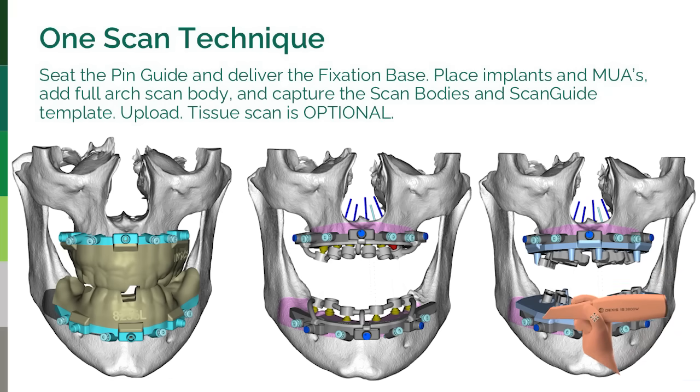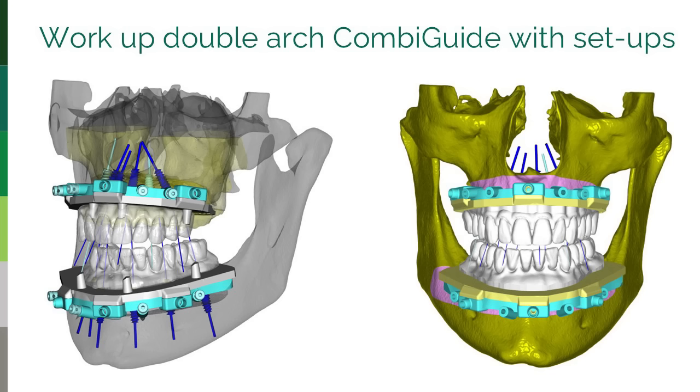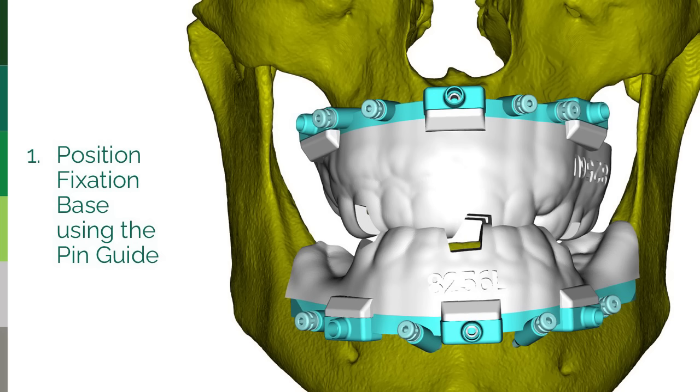And then you can even capture some of the fixation base to give us a nice 3-dimensional geometry, and then do the same for the upper, and that's what you upload. Simple process. And once we have the files, we simply introduce them back into our stack, register it back into the case that we designed, and then we'll make you a prosthesis.